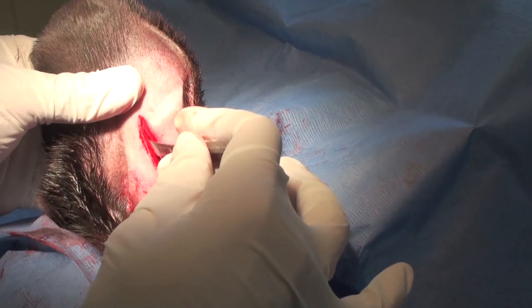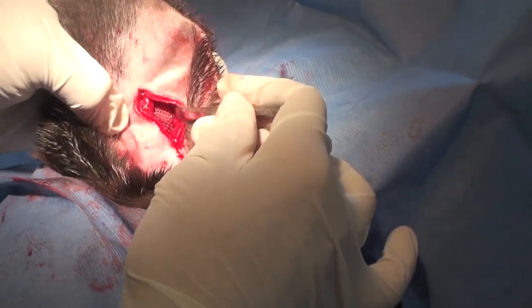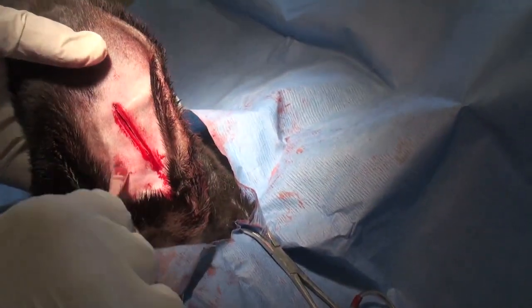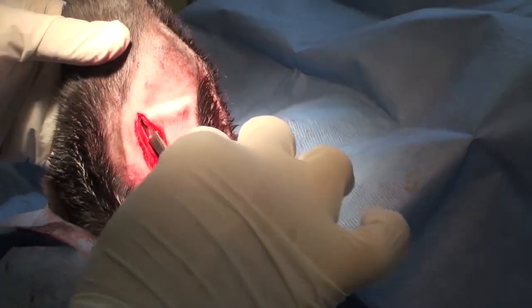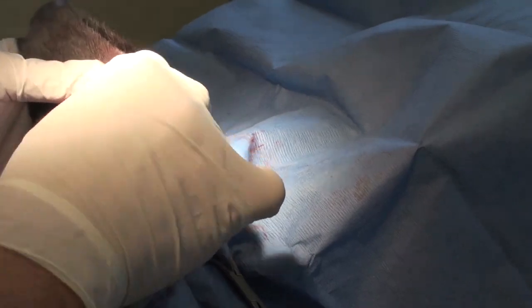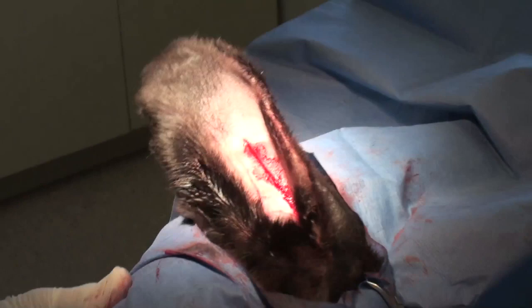The implant is now in position. Let me open here — look, this is the mesh. I use the same elevator to be sure that the mesh is open widely to have a good contact. It's going to be easy for this mesh to anchor in a standing position. Now the ear is extending — you can see that. And that's what they wanted.